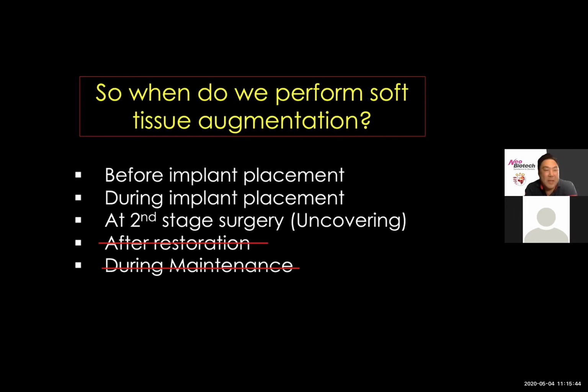One thing is patient management. They'll come to you and ask you, why do we have to do this now? Why didn't you do this before? You know, why did the soft tissue shrink, or why did we get relapse? Why didn't we address this from the beginning? So those are all issues that we want to try and avoid. And I would say the best scenario would be at the time of either implant placement or even at the time of uncovering. So we have that option.